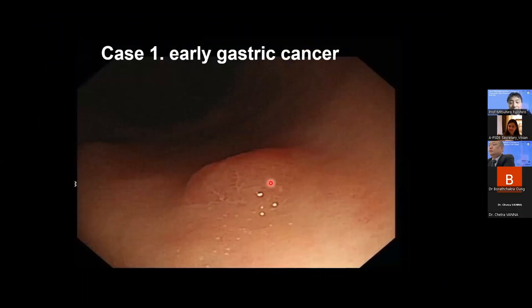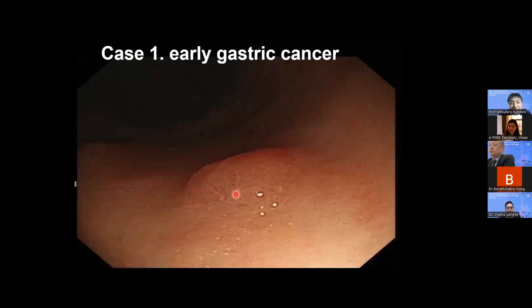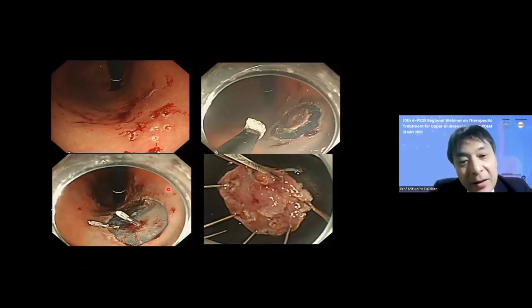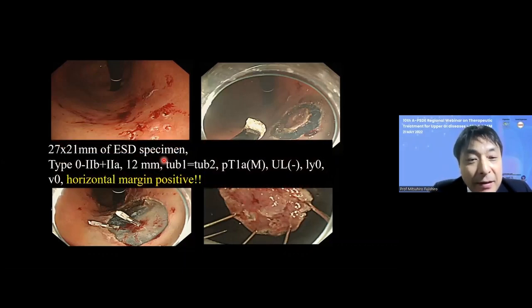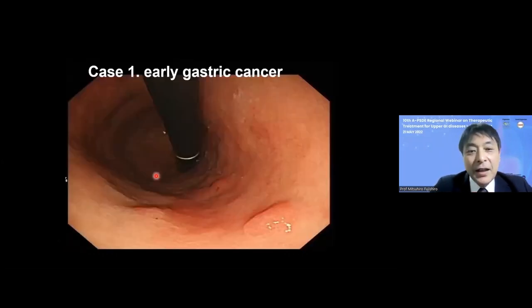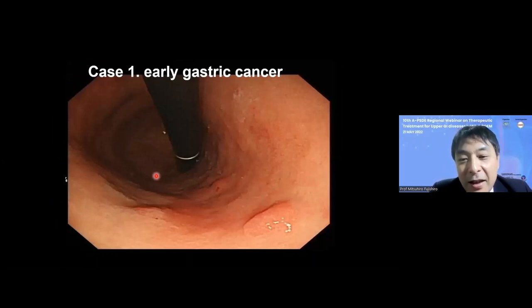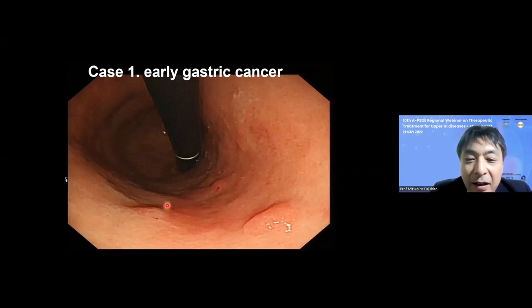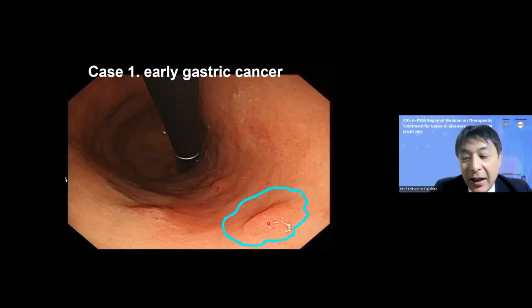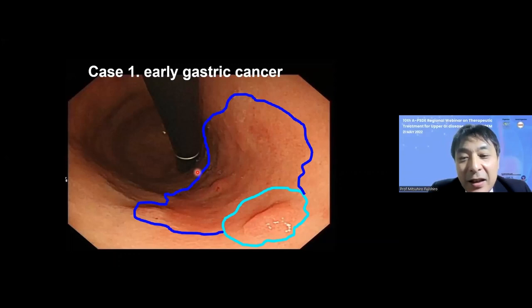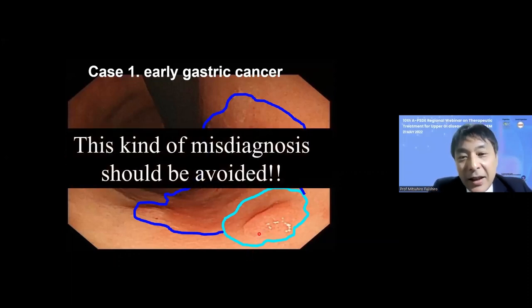This white light image shows a protruded region diagnosed as 2a type gastric cancer, for which ESD was performed. However, the final diagnosis of the resected specimen revealed horizontal margin positive. On careful re-observation, a widespread depressed reddish region is visible in the proximal part of the protruded area — that area should have been included in the dissection. This kind of misdiagnosis must be avoided.